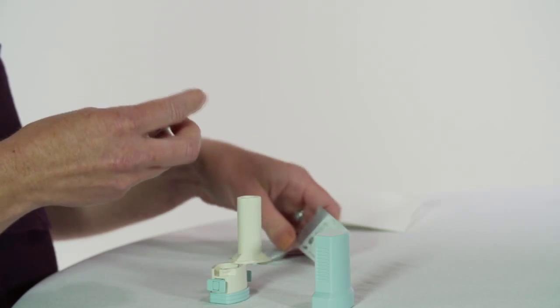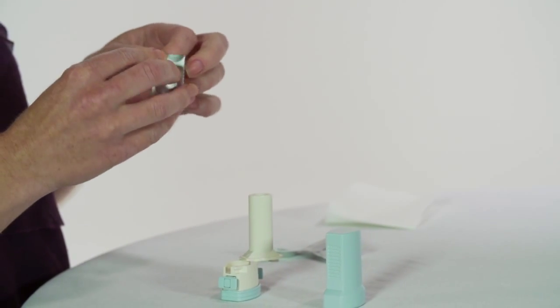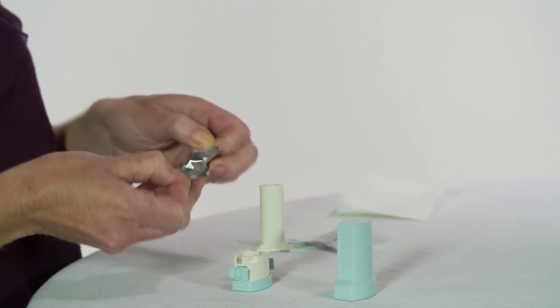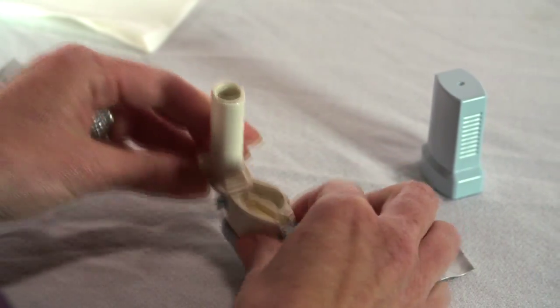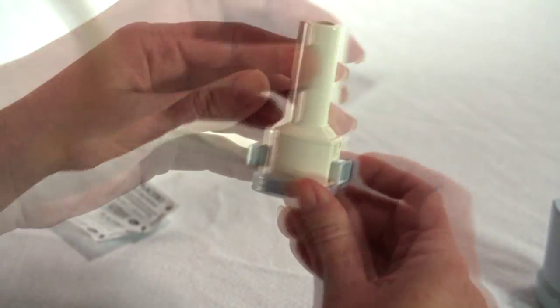Remove a capsule from the blister pack. Place the capsule into the base of the inhaler. Twist the mouthpiece closed until it clicks.